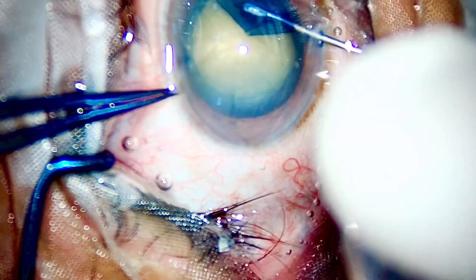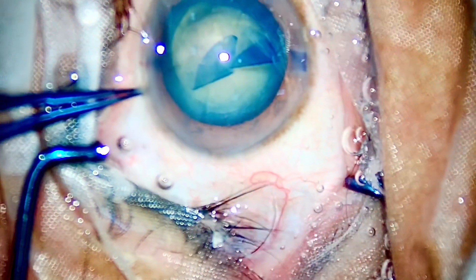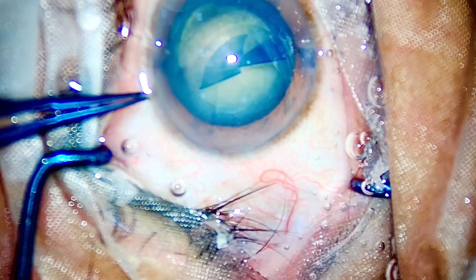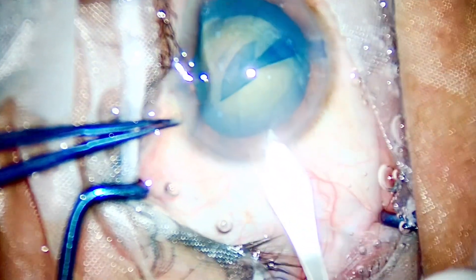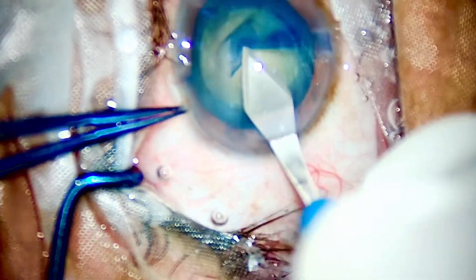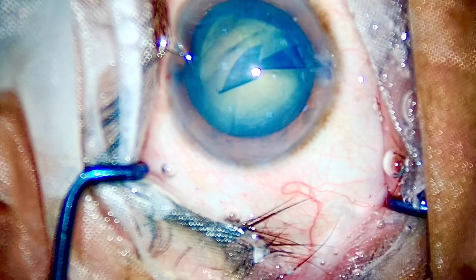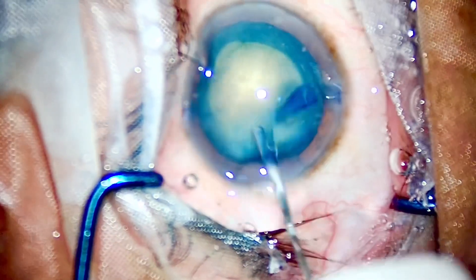The whole procedure will become really easy if I manage to have a good-sized rhexis. All new surgeons, kindly make it a point to enlarge your rhexis or make a good big-sized rhexis when the cataract grade is hard. I've made a biplanar main port and, as I showed you in the diagram — bevel down.